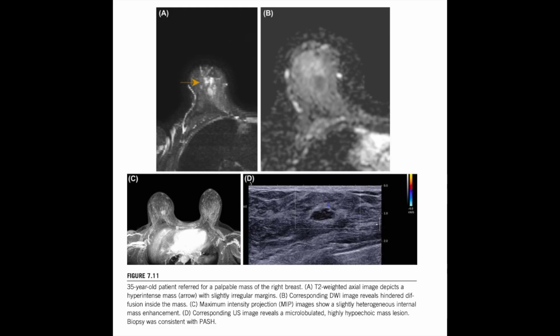But the healing process happens in stages. And in phase 2, the scar formation phase, the body creates granulation tissue. And granulation tissue needs new blood vessels. It requires angiogenesis, new blood vessel formation. Which means new blood flow. Which means contrast enhancement. And that temporary enhancement can look exactly like a tumor recurrence. That's a huge problem. It is. The enhancement is often peripheral, so it's around a fatty center, and it can look highly suspicious.